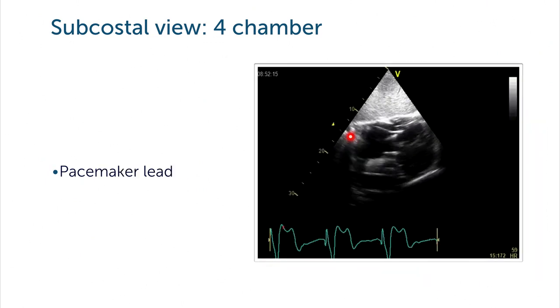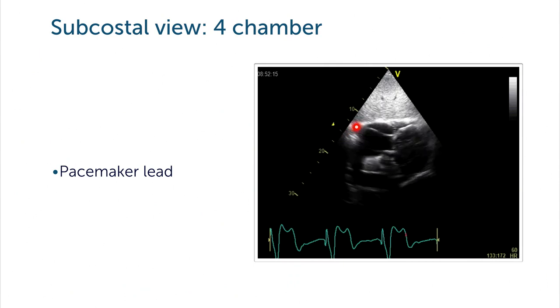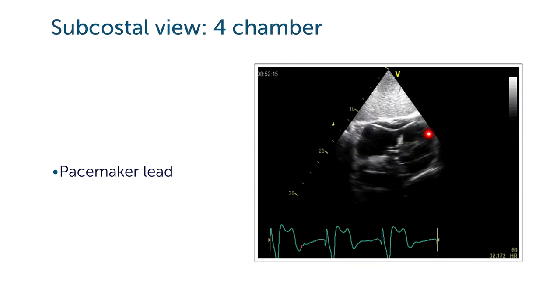And we can also look at pacemaker leads. This view is ideal to follow the pacemaker leads as they go through the tricuspid valve into the right ventricle.